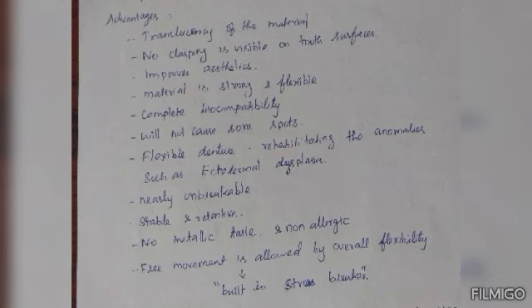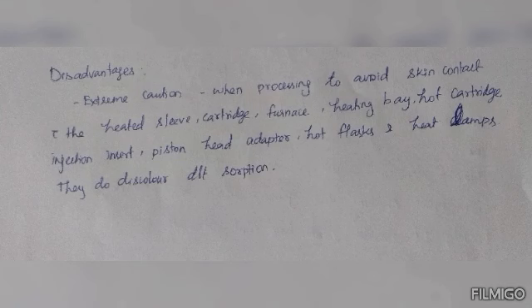Flexible denture helps in rehabilitating anomalies such as ectodermal dysplasia, and it is nearly unbreakable, stable and retentive, with no metallic taste because no metal is used, and it is non-allergic to the patient, and free movement is allowed by overall flexibility. So here it is a built-in stress breaker. It has a lot of flexibility, so there is free movement. These are all the advantages of the flexible denture.